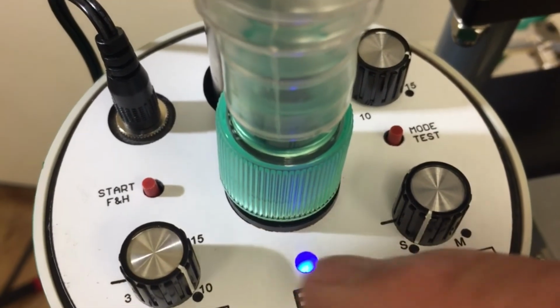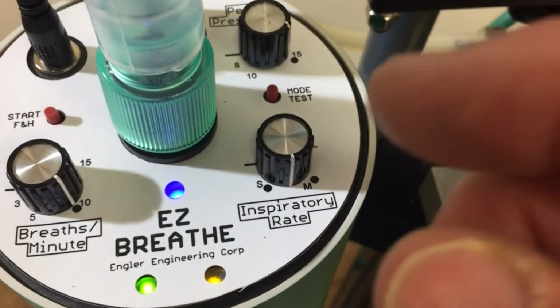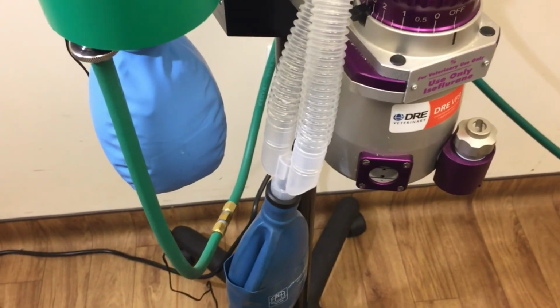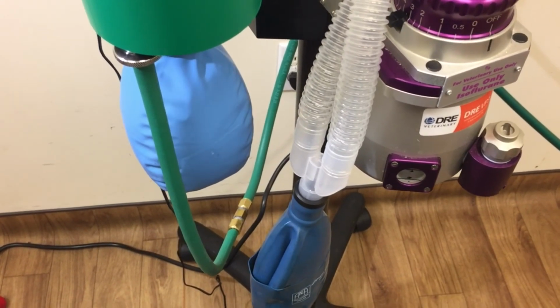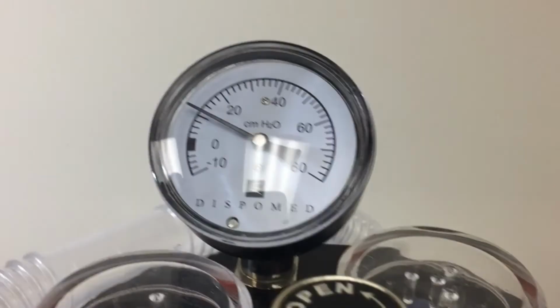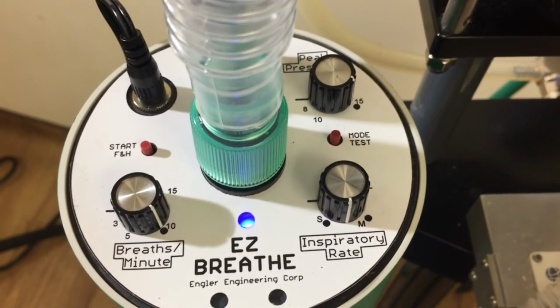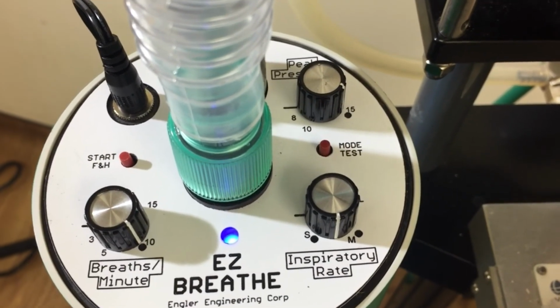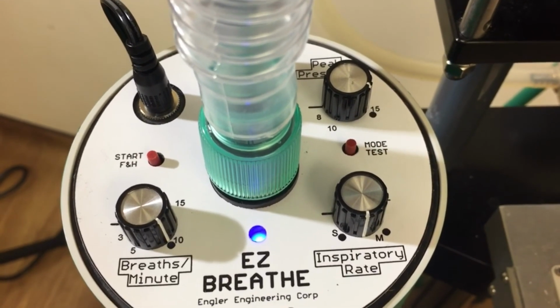To start the ventilator, press the start button and immediately release it. We are now ventilating the patient. As can be seen by the bag, the test lung is inflating as the reservoir bag compresses. And looking at the manometer, we see the pressure goes up to about 15 centimeters of water. To turn the ventilator off, press and release the start button. We will now go into detail on how to set and adjust the controls.